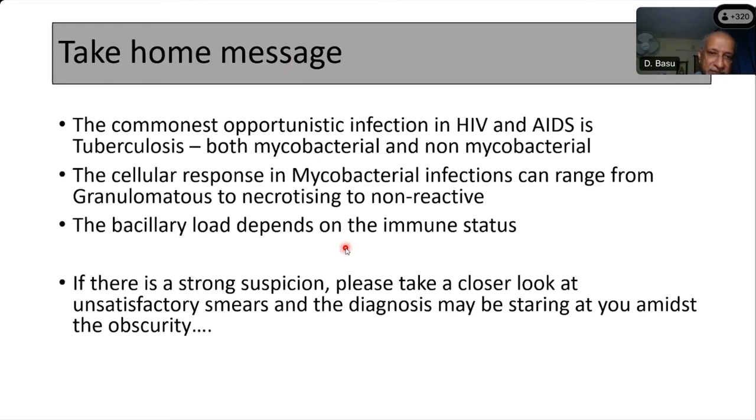Yes. Sir, another question is, what should be the stain of choice for fungus among all the available special stains? I think PAS still is good. PAS is a good stain. It highlights, and GMS is of course confirmatory. So between these two, you can use. Generally, we use both. Some of the PAS, especially the zygomycosis and all, are not too strongly PAS positive, but GMS is a good stain. Cryptococcus is mucicarmine positive, amongst the only fungi which is mucicarmine positive.